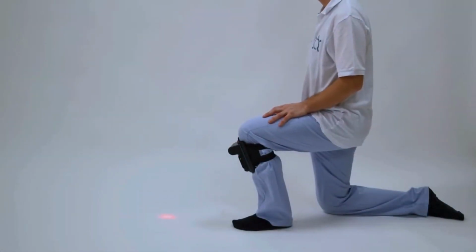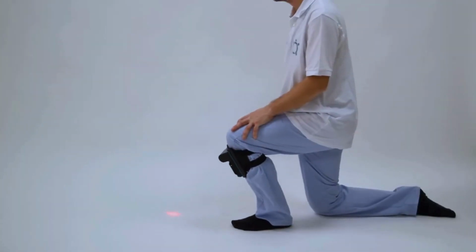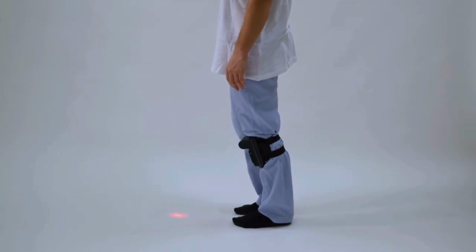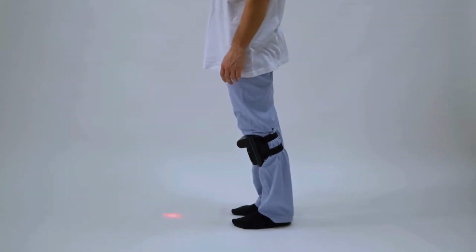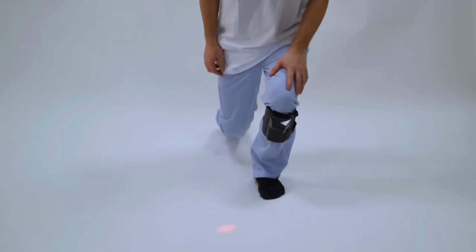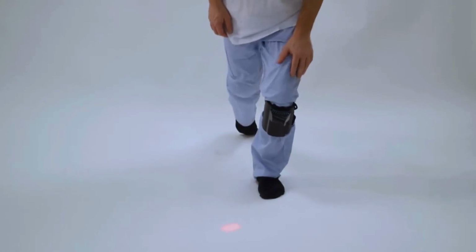Cavalier servant, change of stance. It is the classic posture change exercise with the addition of visual feedback. The patient is required to switch from the cavalier servant position to the upright one, helping to maintain stability and balance with the visual feedback generated by cue walk.